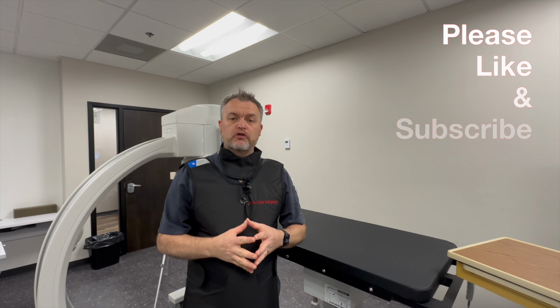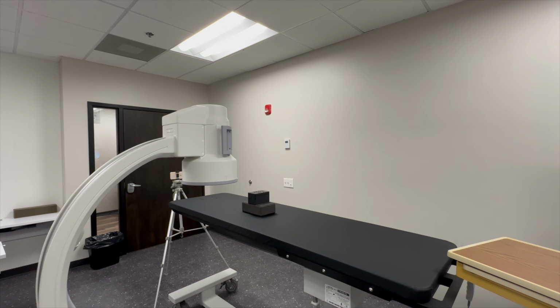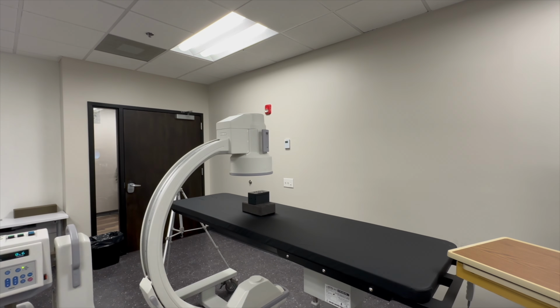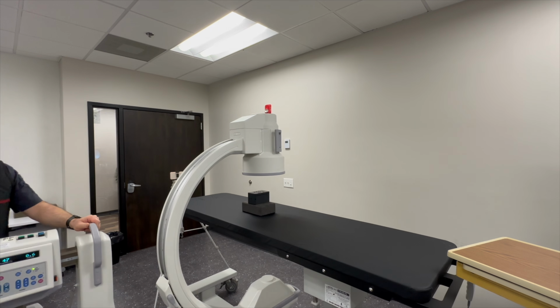So today we will look at how we can open up perfect circles when we have a compressed or oval shape and we really want to get that circle nice and true. So again, we're using my phantom here and I'm going to come in. Now it doesn't matter if you're doing this in an AP fashion or a lateral position. If you're in the lateral, then you just replace tilt with wag as I described them.